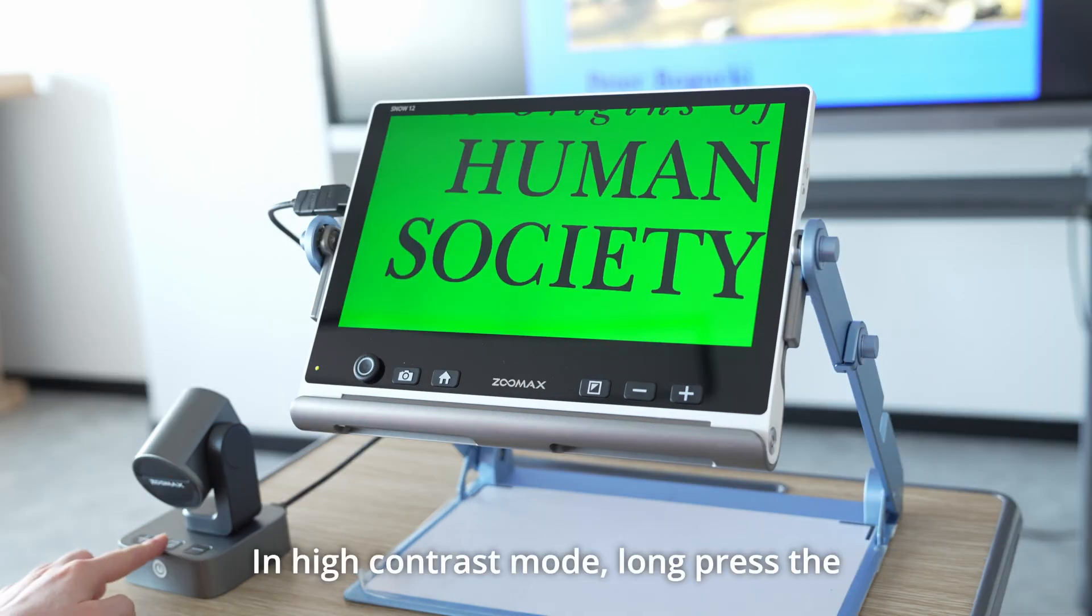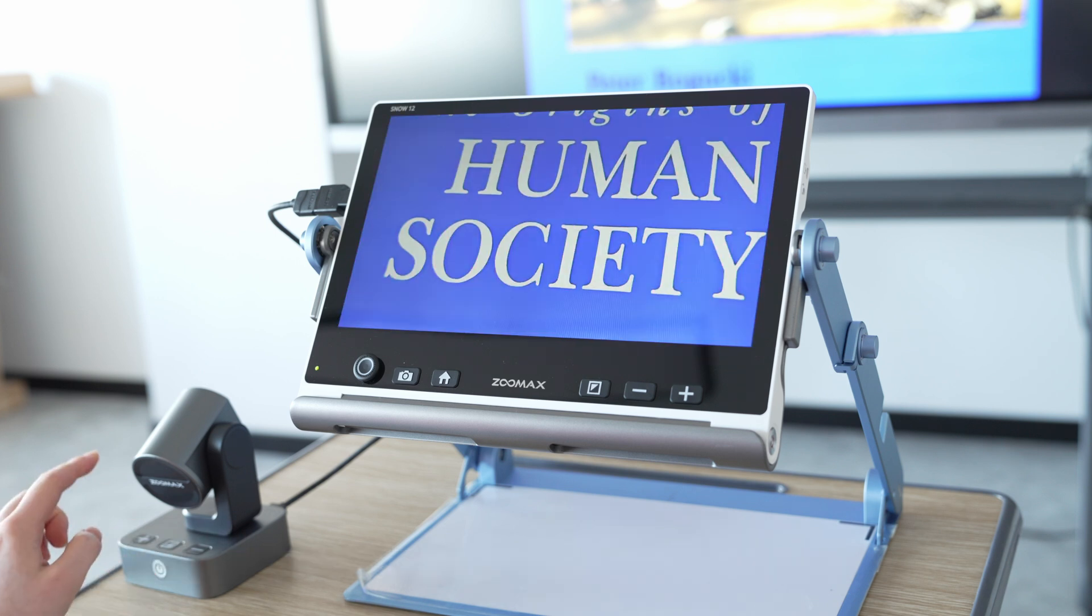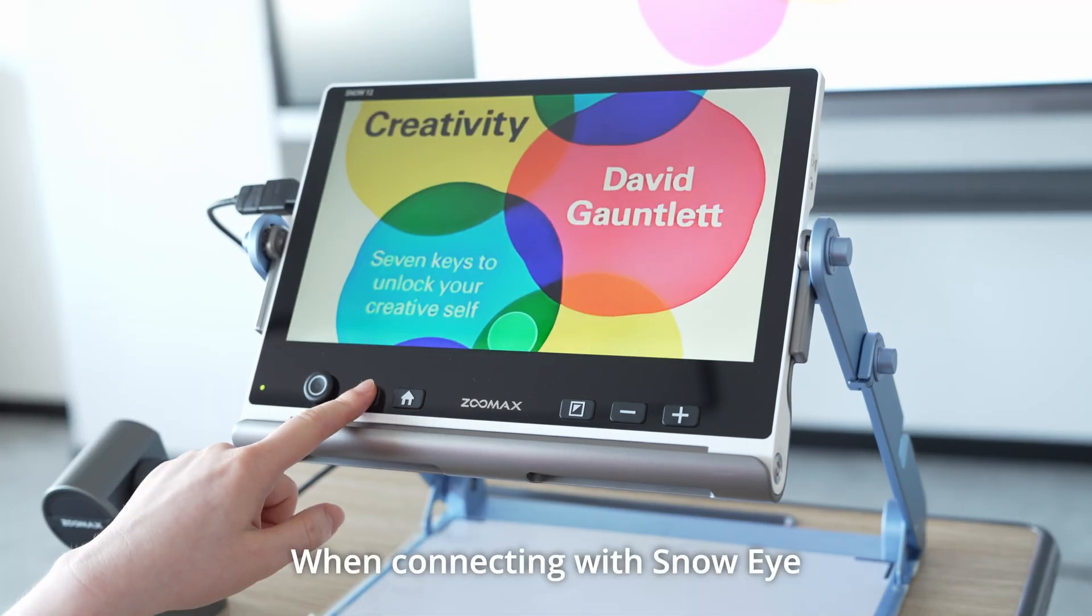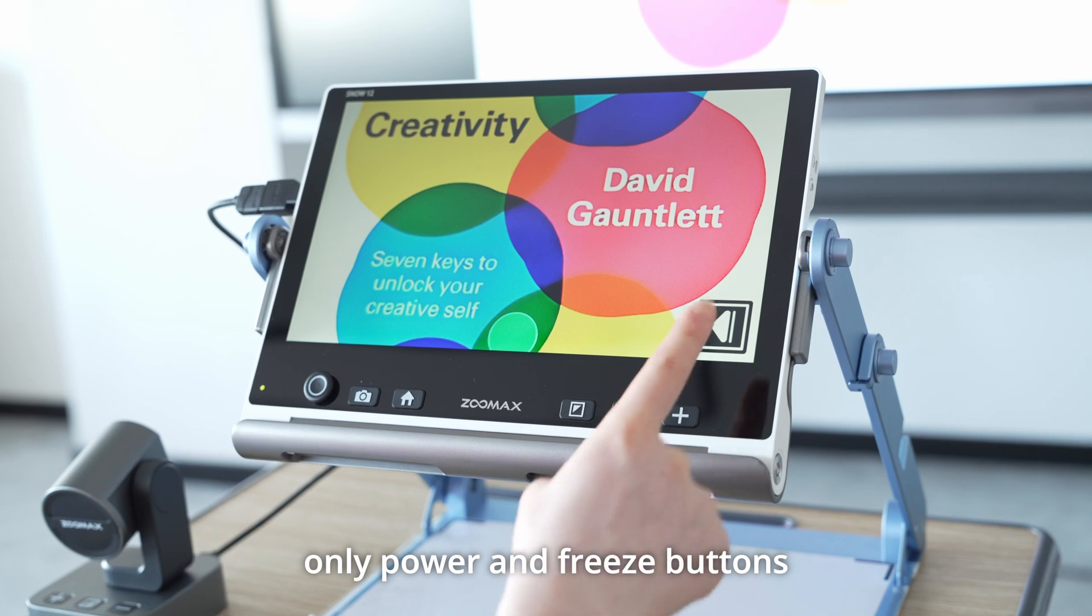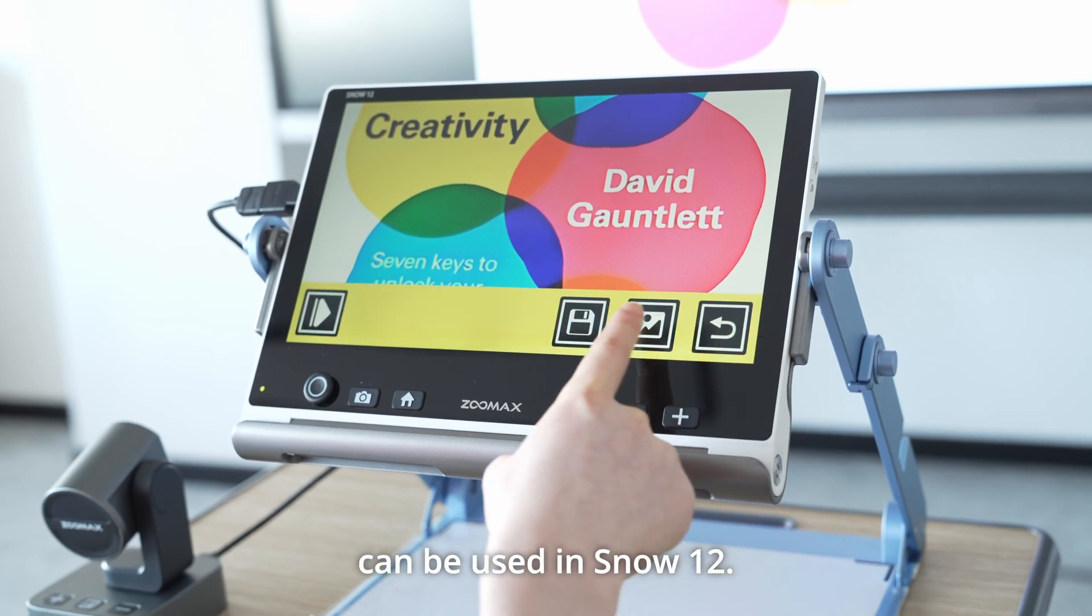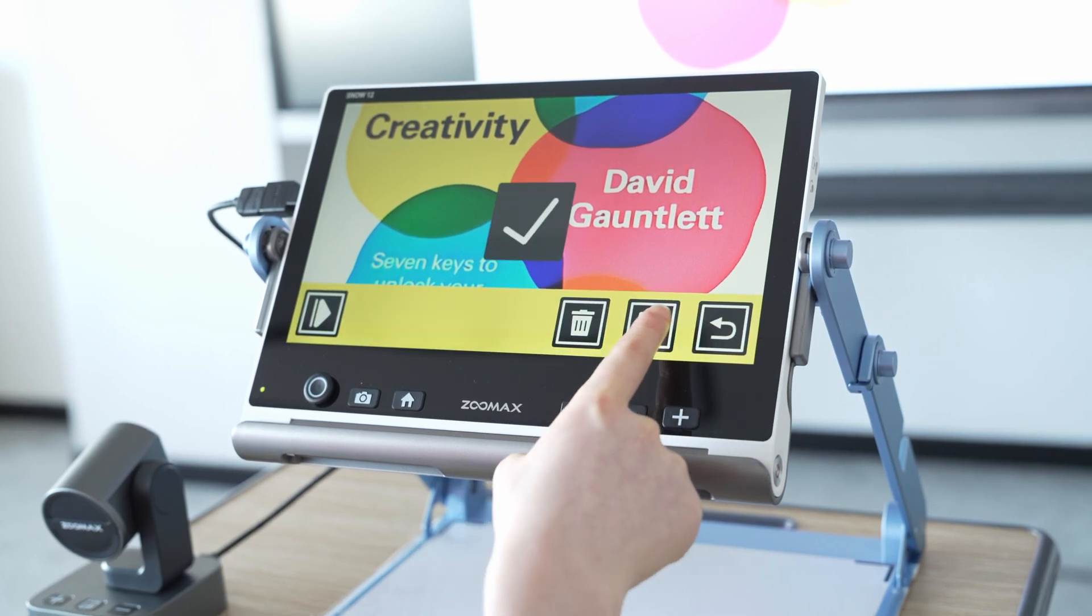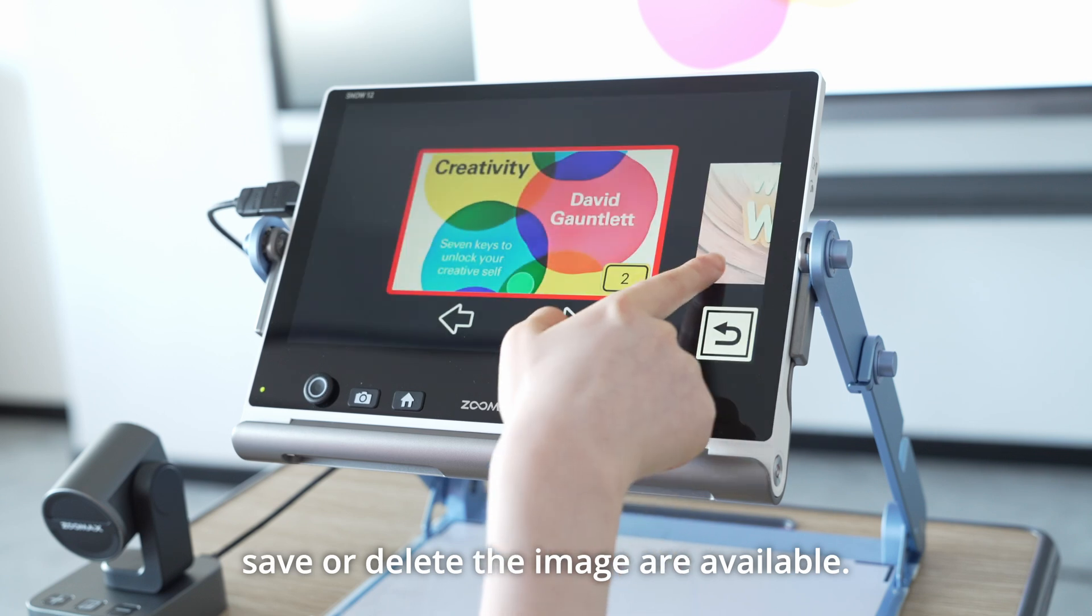In high contrast mode, long press the color mode button to get the true color. When connecting with Snow Eye, only power and freeze buttons can be used in Snow 12. Capture and view, save or delete the image are available.